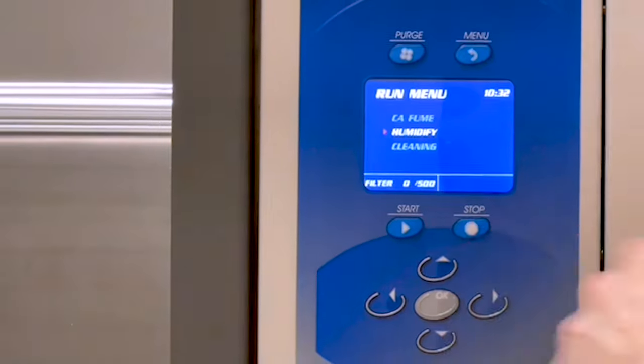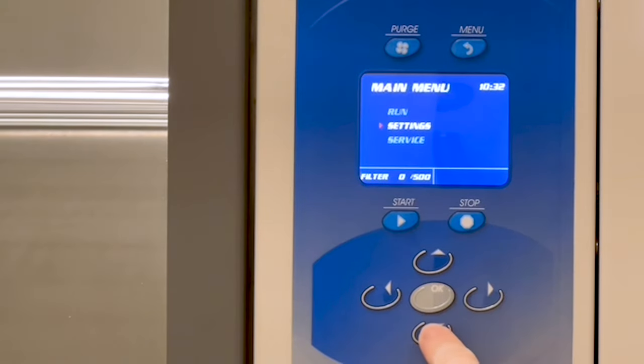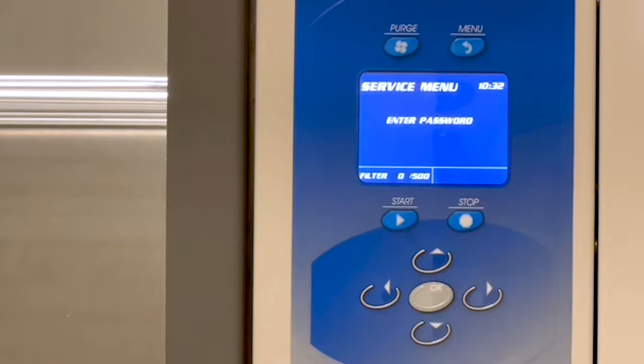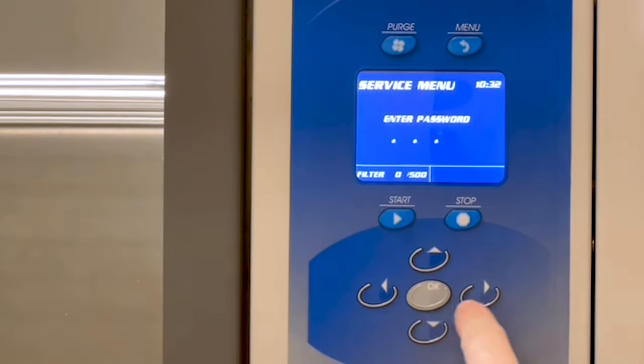Press Stop, then the Menu button to access the main menu. Select Service and press OK. You will be asked to enter a password: press up arrow, down arrow, left arrow, and right arrow.